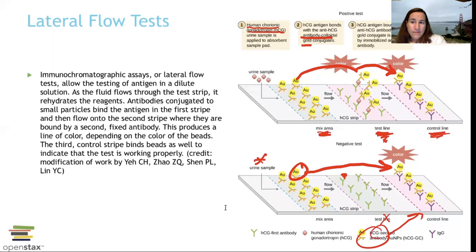Will this go off if you are testing yourself 24 hours after intercourse? No, it won't. You need it to build up in your system to be able to set this off. So this is your lateral flow test.